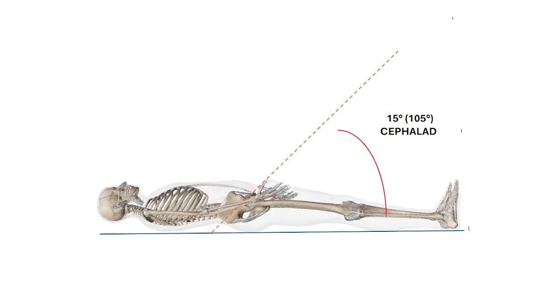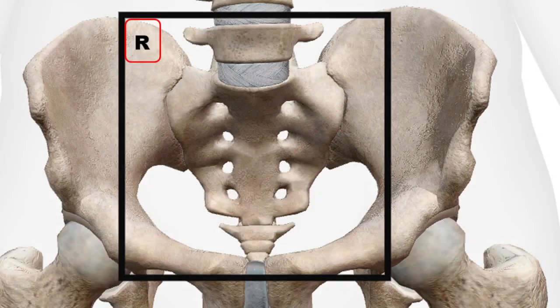Put a pillow under the head for comfort and legs extended. Place a support under the knees for comfort if desired. Angle the central ray 15 degrees cephalad as shown. Use proper collimation and place your right marker in the upper right of the light field as displayed.